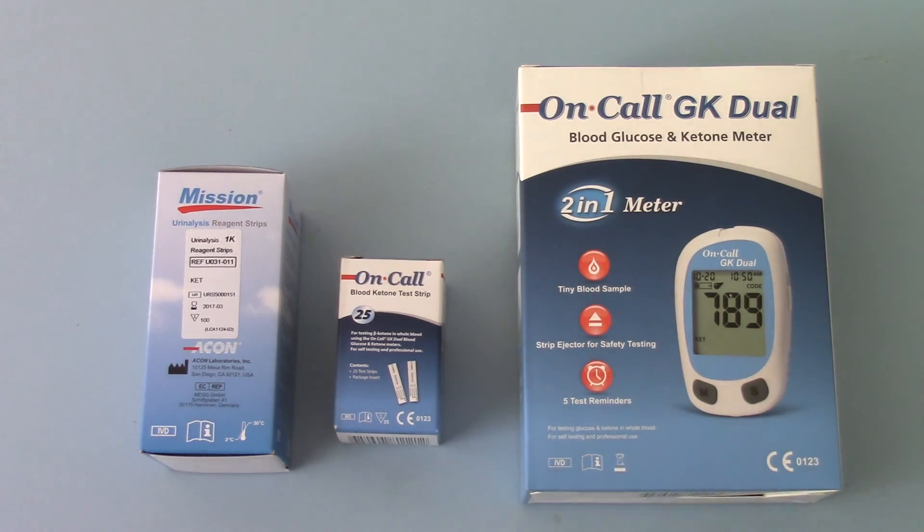So there you have it — your two options if you are interested in screening yourself for ketone levels.